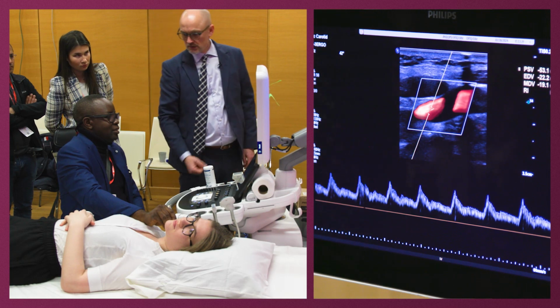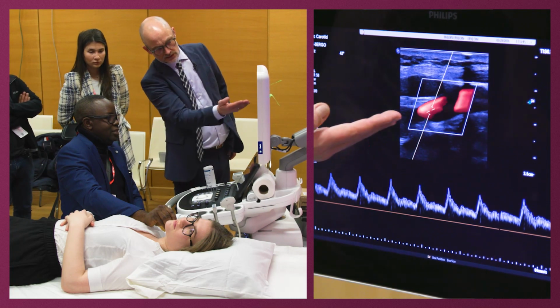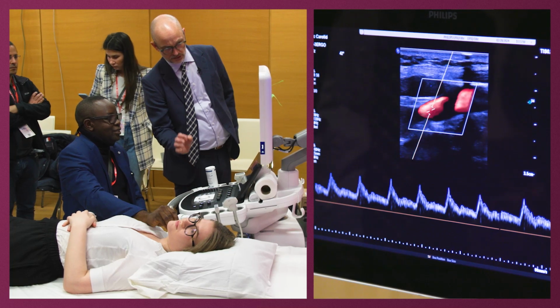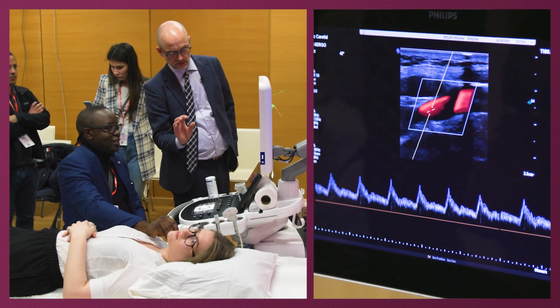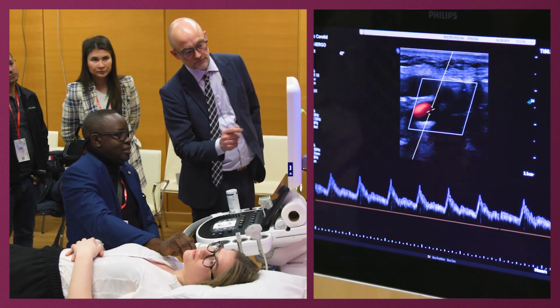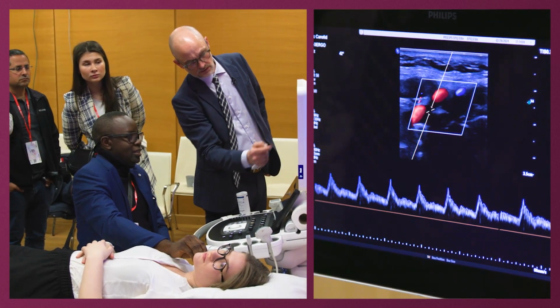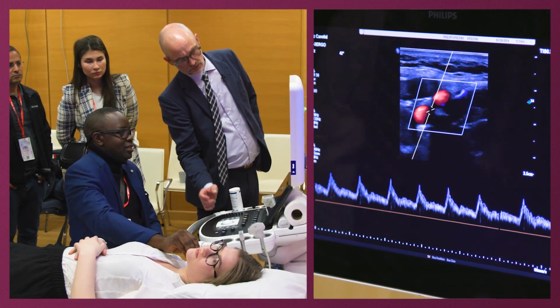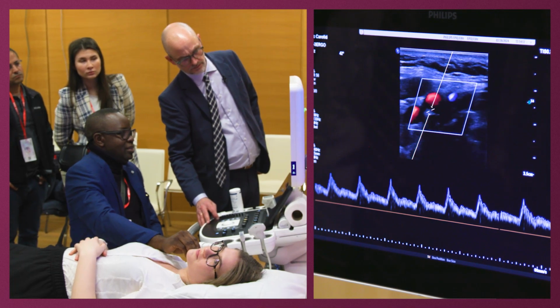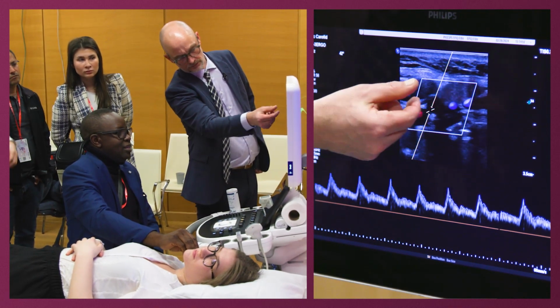Is this to the brain or to the skin? Brain. Brain, I agree. So now this is the internal. Try to find the external. And this is small rotations. And small, but it's in your fingers. Something's going on here. Try to follow this one. Try not to push too hard. It's not that nice for the patient. So you should try to make this a tube.